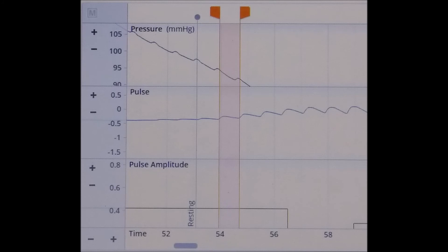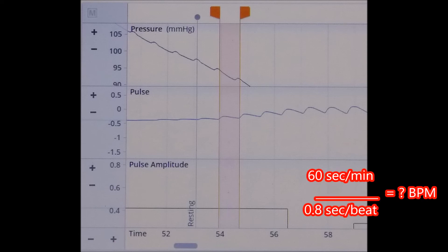We will also need to calculate the patient's heart rate in each one of these conditions. Use the bracket tool to select the region from the start of one beat to the start of the next. Look to the bottom of the screen and determine how much time has elapsed. Finally divide 60 seconds per minute by the duration of the beat. In this case we have 0.8 seconds per beat. This will give you the patient's heart rate.